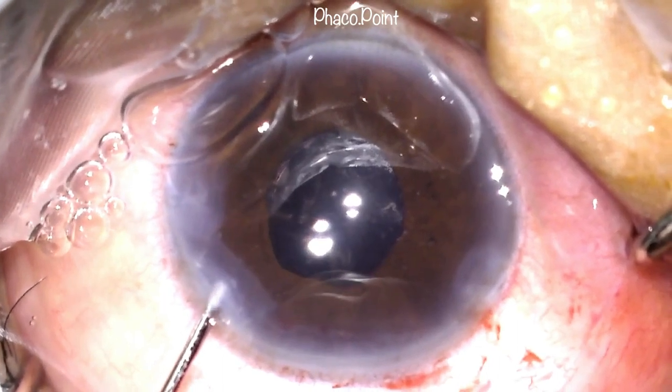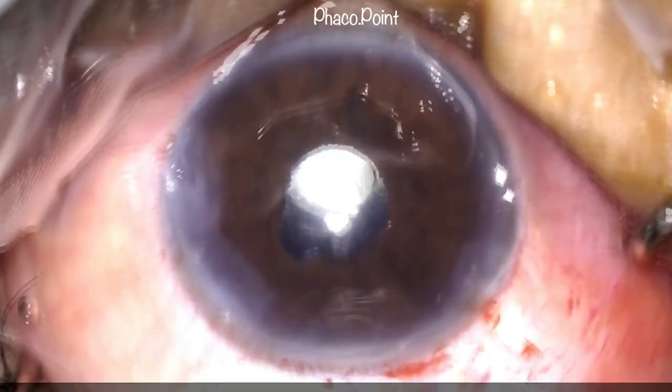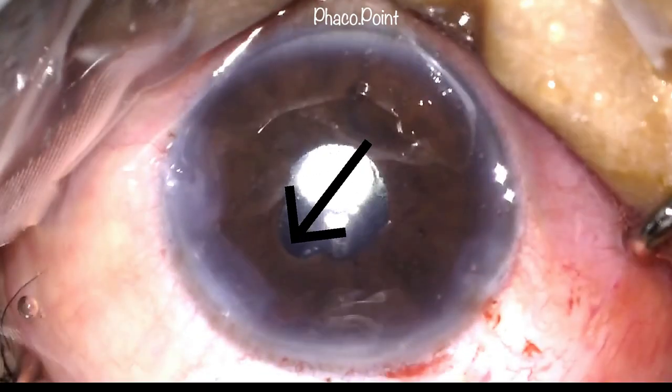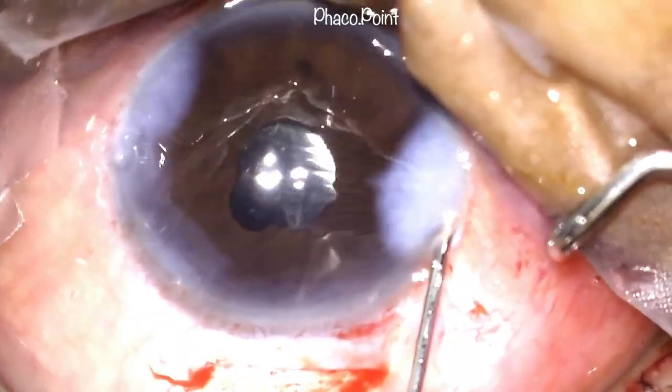This is followed by injection of a little bit of pilocarpine into the eye to bring the pupil down. Notice the little notch that has resulted from having cut the pupillary border with the anterior vitrectomy accidentally. We now proceed with the gentle stromal hydration.